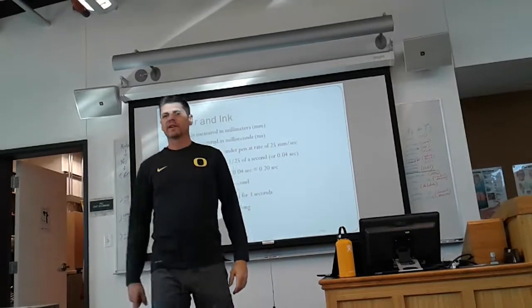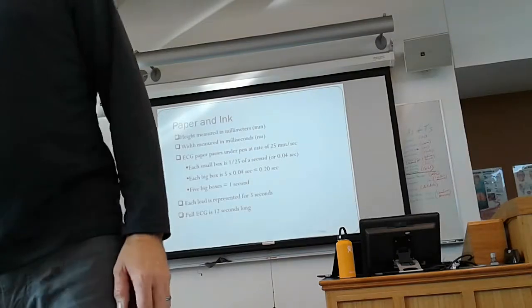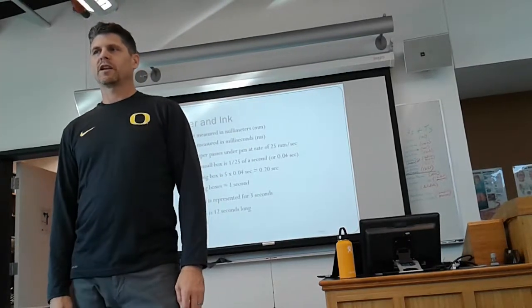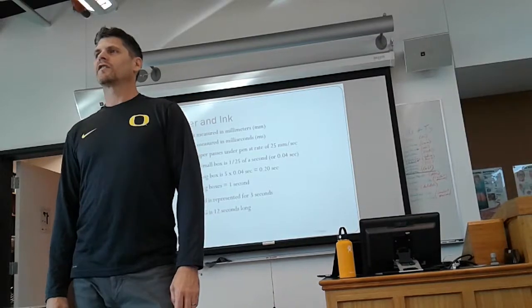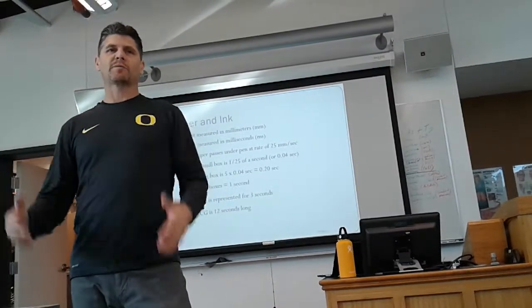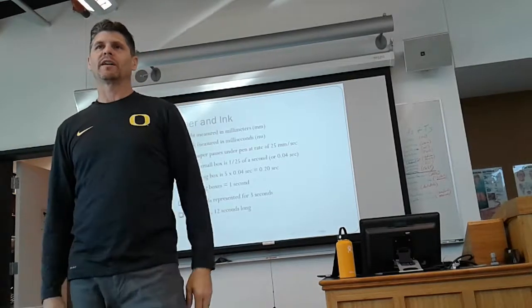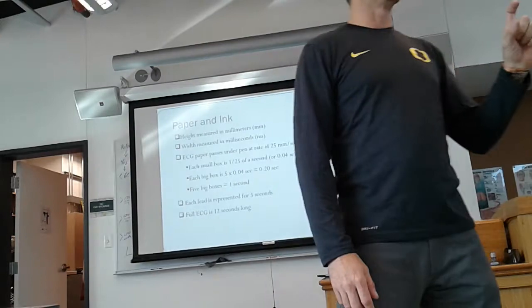You notice the hash marks up at the top. How many large boxes are within a hash mark? 15. So how much time is going by? 3 seconds. So on all of those that I just gave you, how many hash marks have you seen at the top? Three total. One that starts it, one that ends it. So how many seconds is going by? 6. Okay, that's a standard way for us to look at single leads.